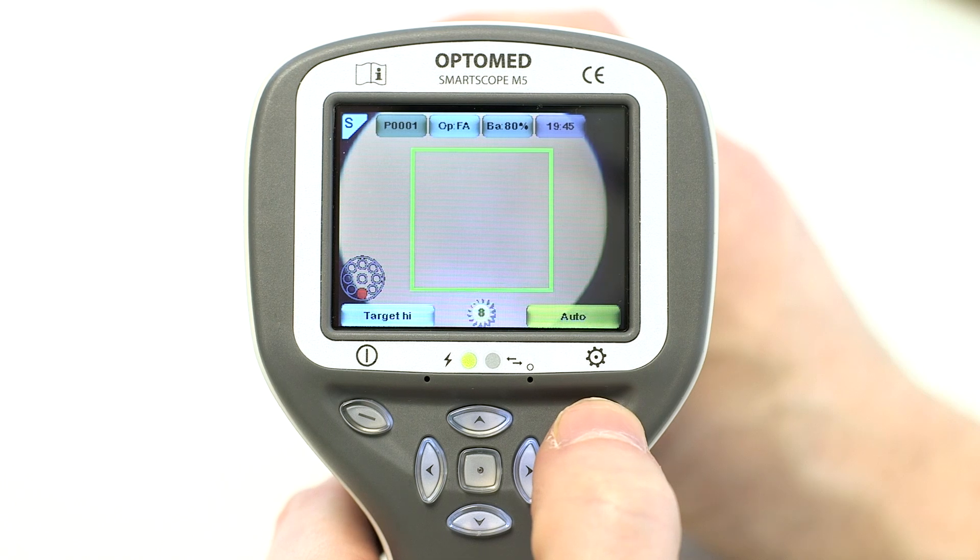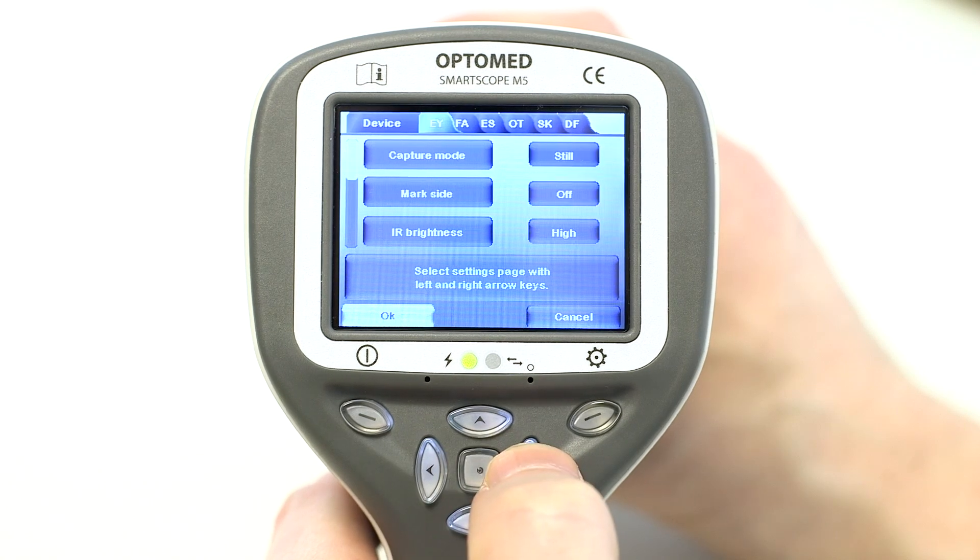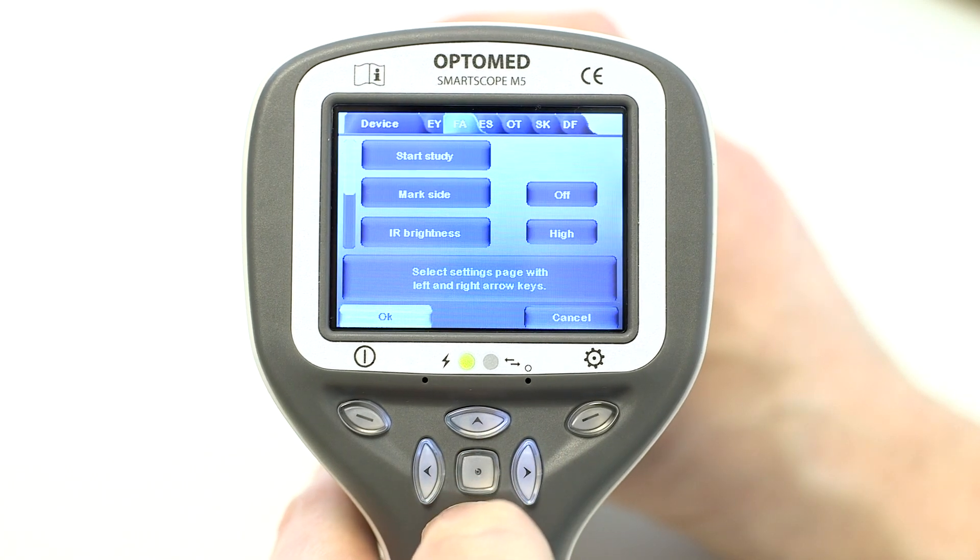After fluorescein has been injected, the study can be started. The study timer is started by selecting start study from the FA menu or by taking the first image with FA attached.